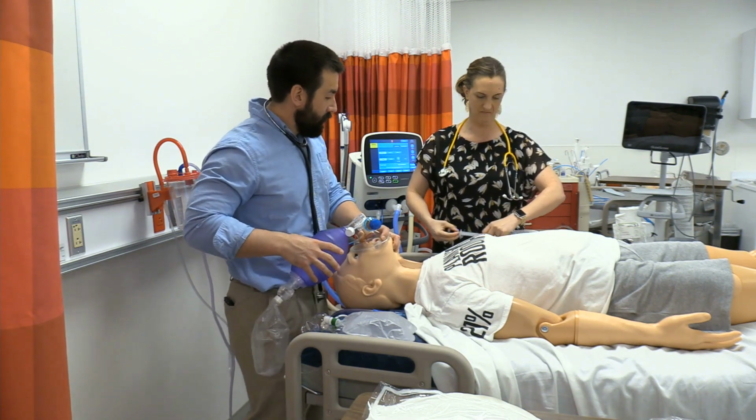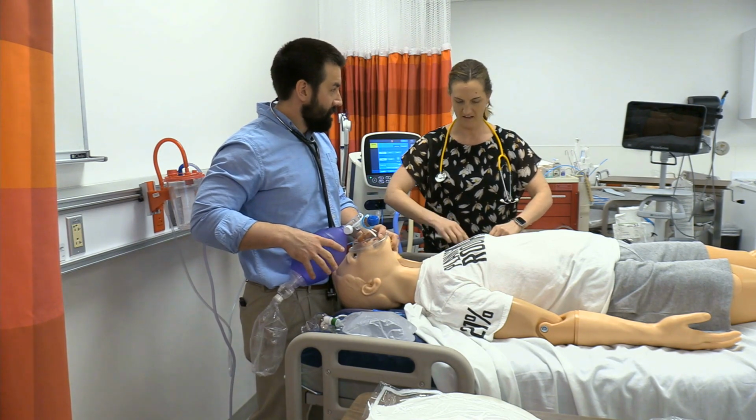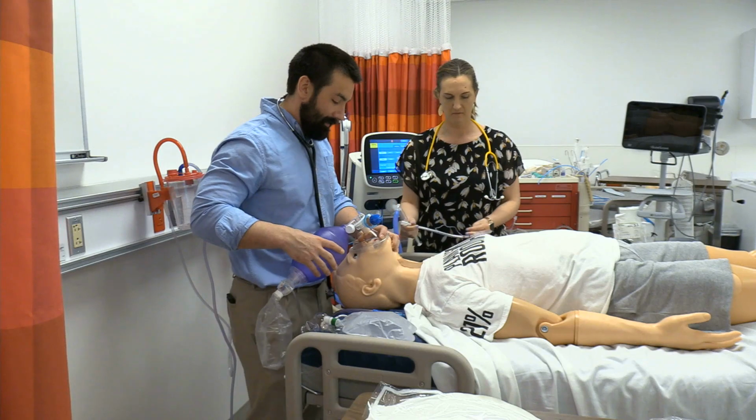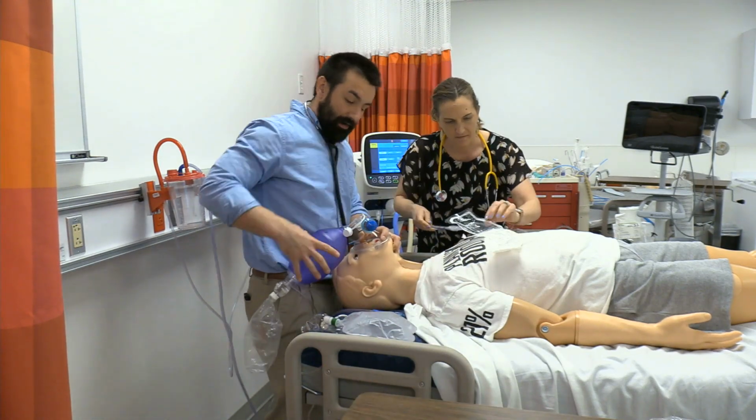I got a little bit of lube over there as well. I don't know if you had any. I don't carry that with me at all times. Sometimes I do, in my pocket. We're good. Alright, well, I've got a little bit of lube in that packet there if you'd like.